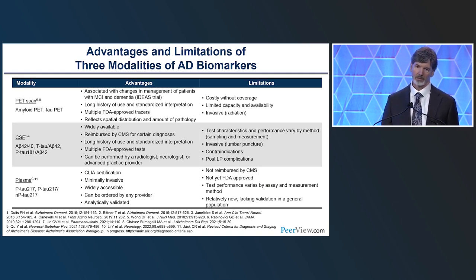But PET scans have been around for a long time. We understand them in imaging very well. There's multiple FDA-approved tracers. However, they are costly. There's some radiation involved, which scares some people. There's limited capacity. CSF is also approved by the FDA. It's paid for by Medicare.